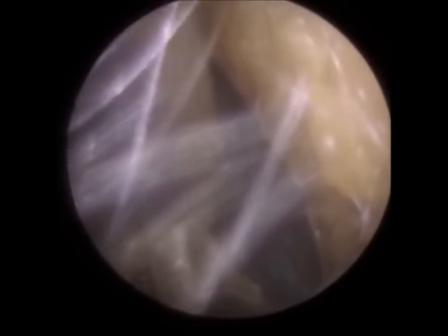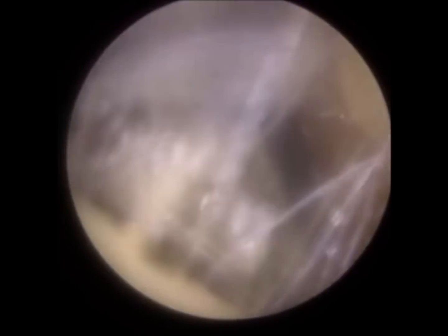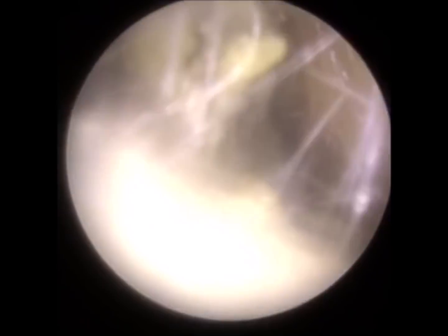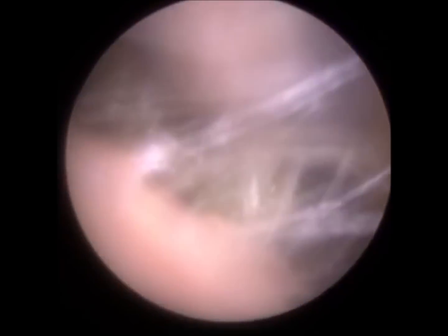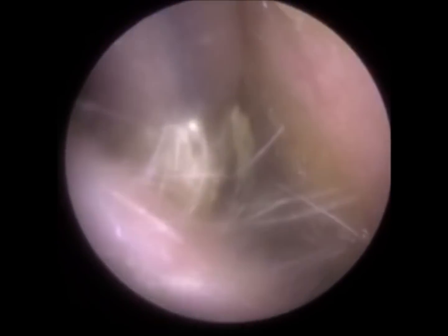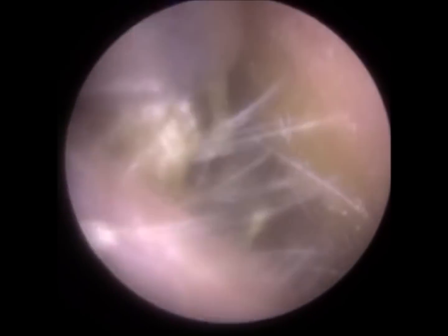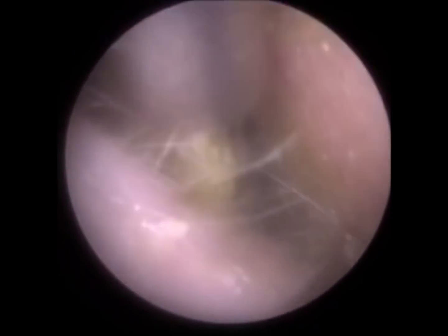So you'll see during the procedure, when I felt one instrument wasn't as effective as it previously was, I've resorted to the other instrument. So using a whole range of different instruments is quite normal. During most procedures, it's very rarely, I'd say about 10 to 15% of the time, that I'm just using one instrument. Quite often we're using multiple instruments. So I'm going to let you carry on watching this, guys.